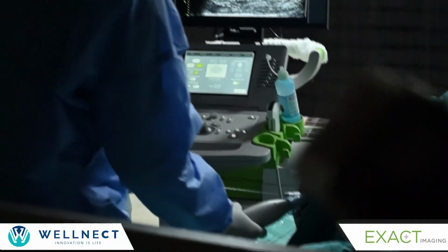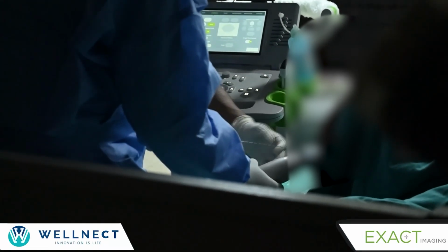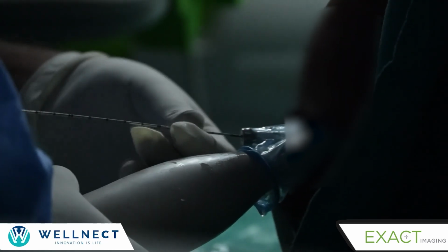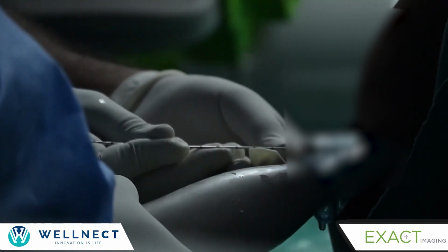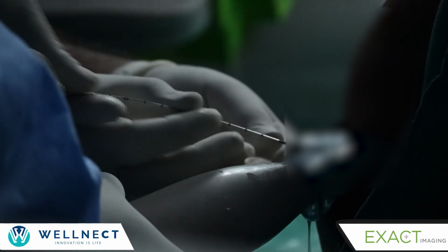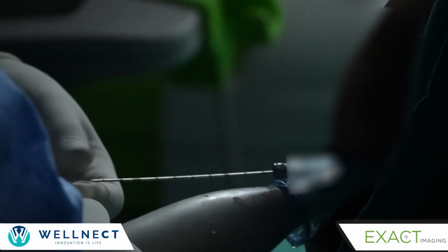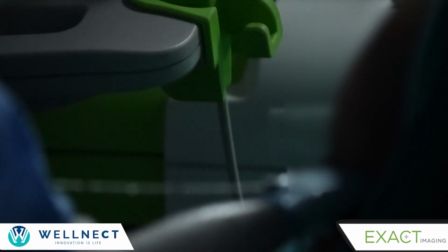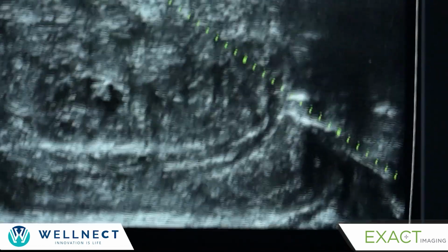Now again I insert this needle to my guide. Somebody can just help me. Okay, so this was the apex that we took. Now we go mid gland. So you come till the prostate. Can you see?